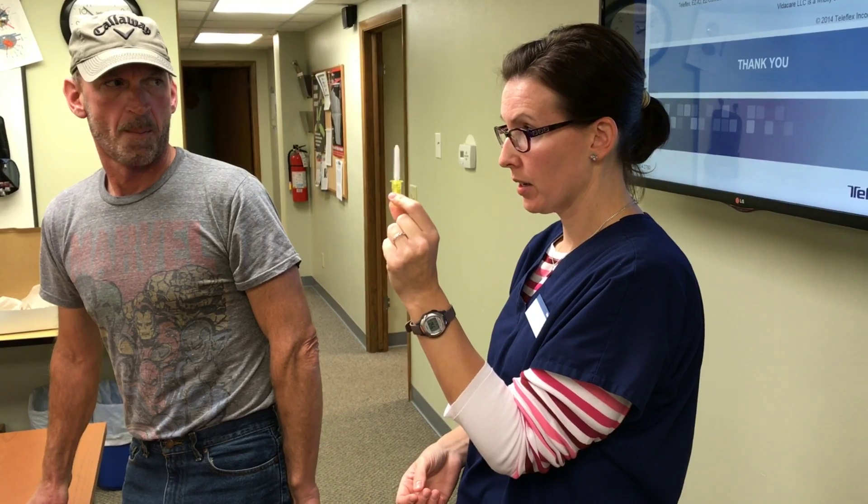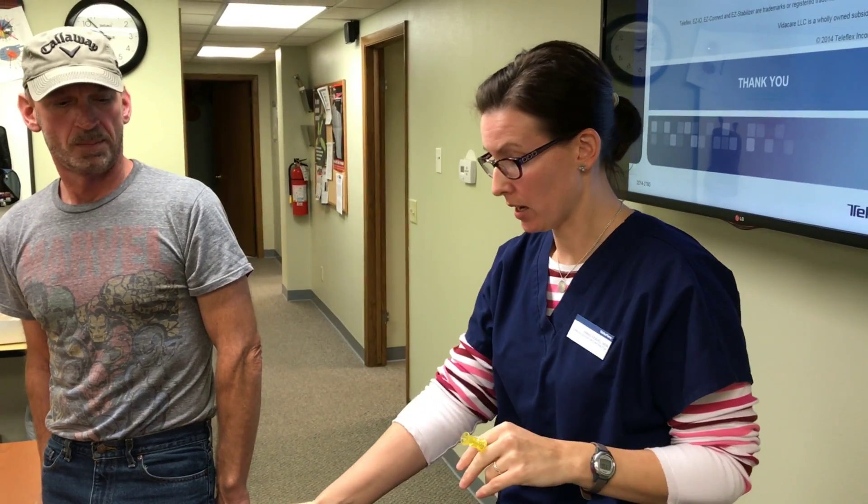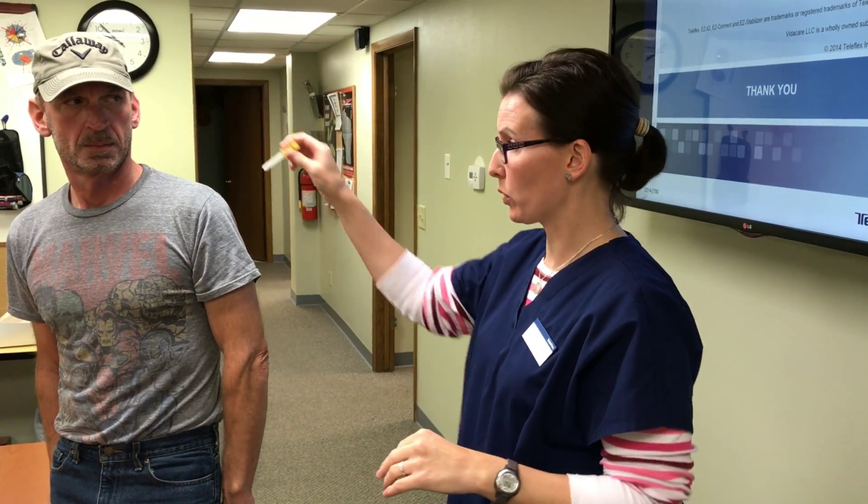Whether they have thin or big puffy shoulders, it's always the 45-millimeter needle for anyone over 40 kilos — grandma, an 18-year-old, always this needle — and it always goes all the way in to the hub. Unlike the proximal tibia where you stop when you lose resistance so you don't go through the other side of the bone, you don't have to worry about that here. It's a big space and the needle goes all the way in, so needle selection is simpler.